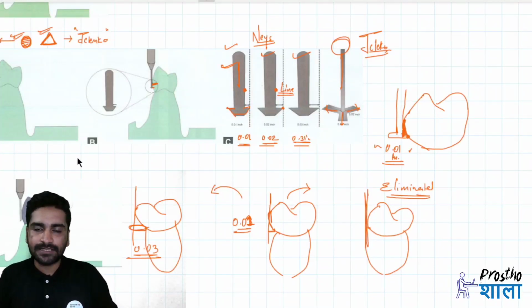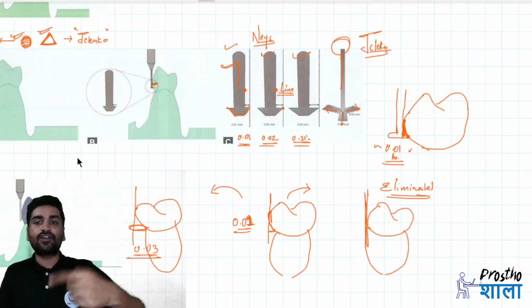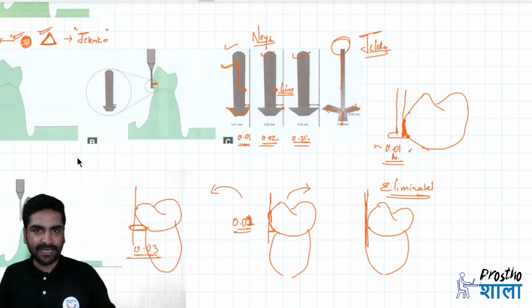In your cast partial dentures, you have to plan, because you are casting it. You cannot repeatedly cast again and again. It is not an easy process, right? Nowadays we have CAD CAM and digital designing over there, right?